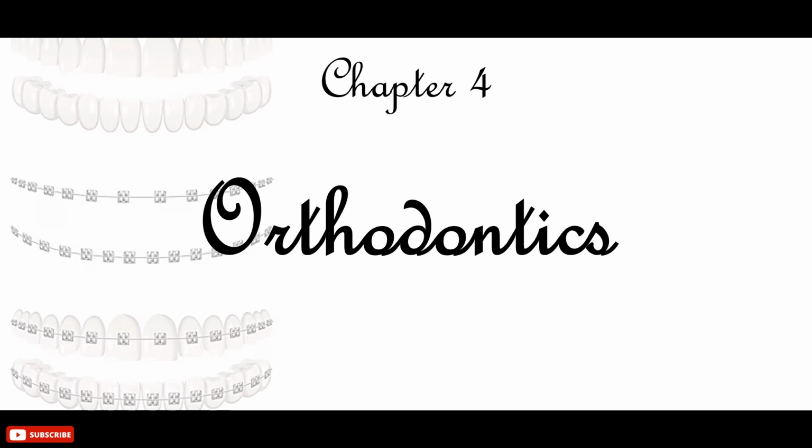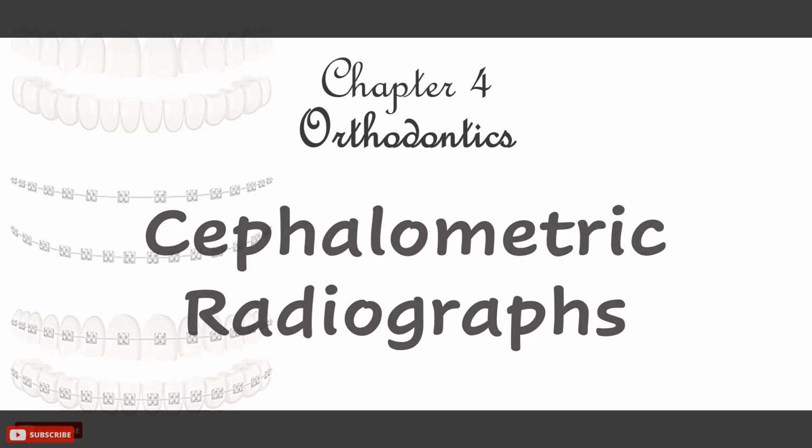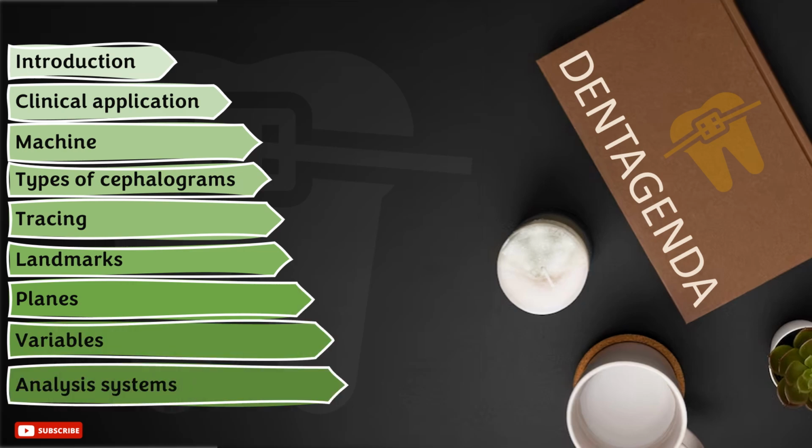This is Chapter 4, Orthodontics. In this tutorial, you will learn about different aspects of cephalometric radiographs in orthodontics. These are the points we're going to discuss throughout the tutorial.